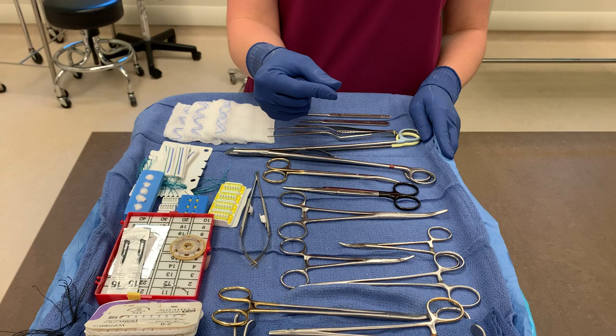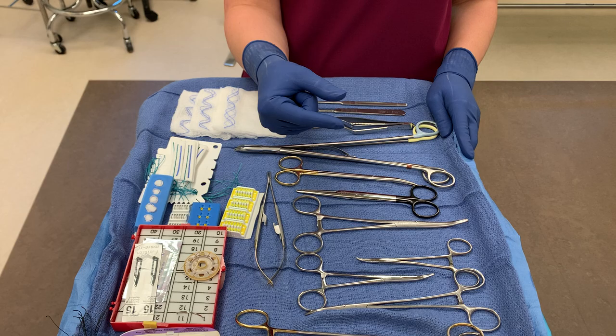The first thing I'm going to show you is hand signals for pickups. The surgeon will put their hand like this and do this right here — that means they want forceps, or pickups as they will call them.